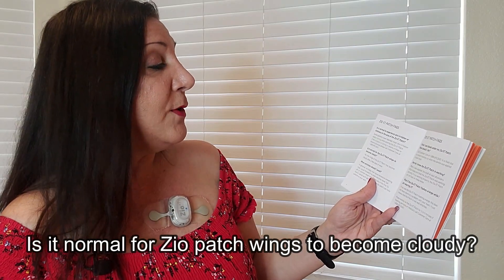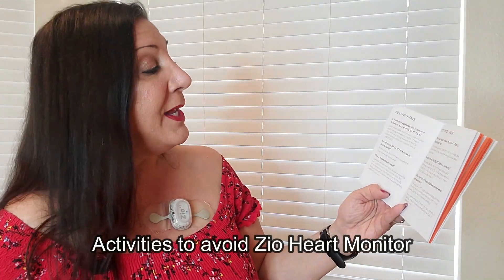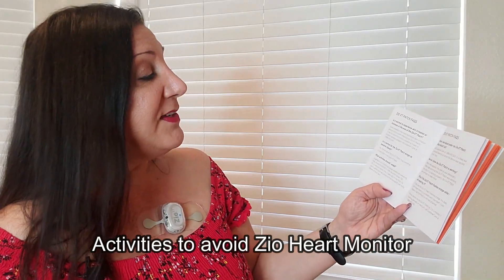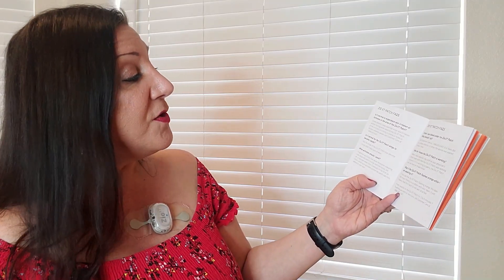Is it normal for the Zio XT patch wings to become cloudy? Yes, the wings may become cloudy after a few days of wear. What activities should you avoid? In general, activities that cause excessive sweating may cause the patch to slide, become loose, fall off, or shorten wear time — especially in the first 24 hours, so the patch can fully adhere to your skin.